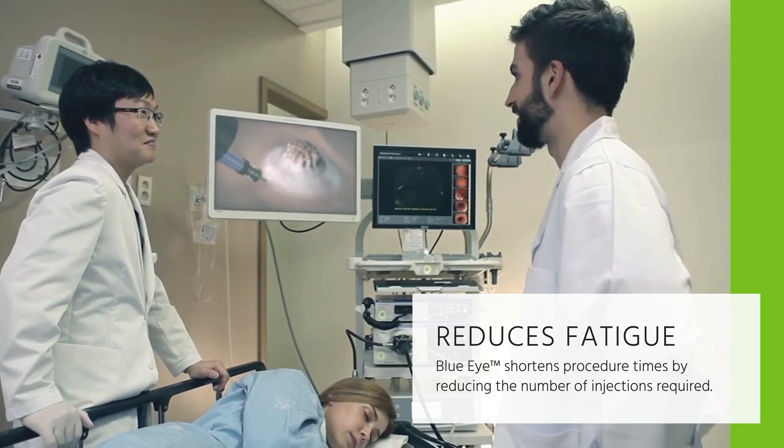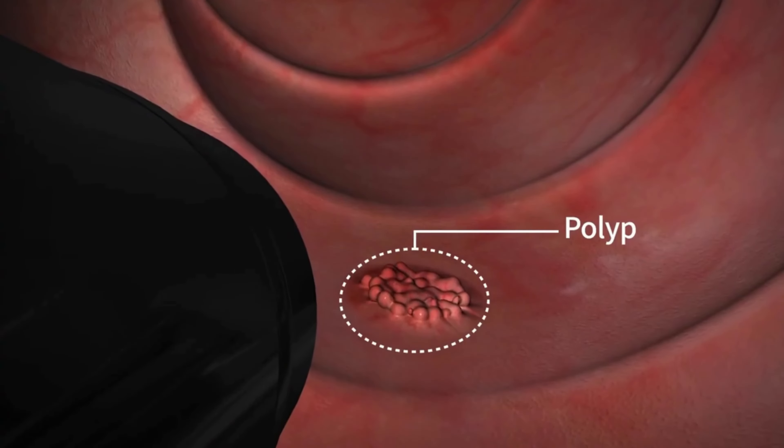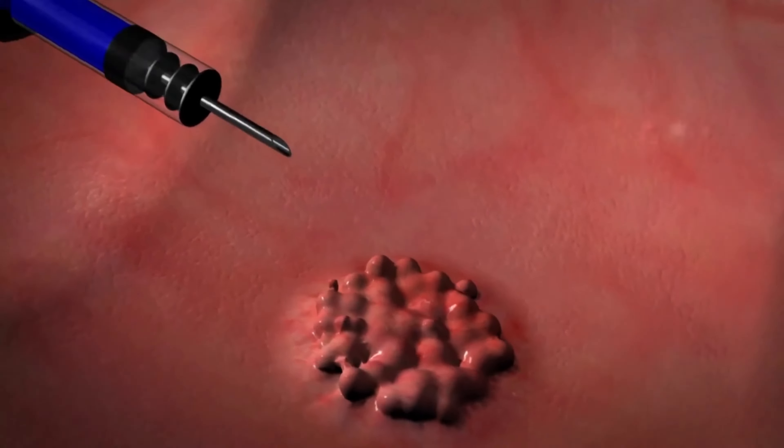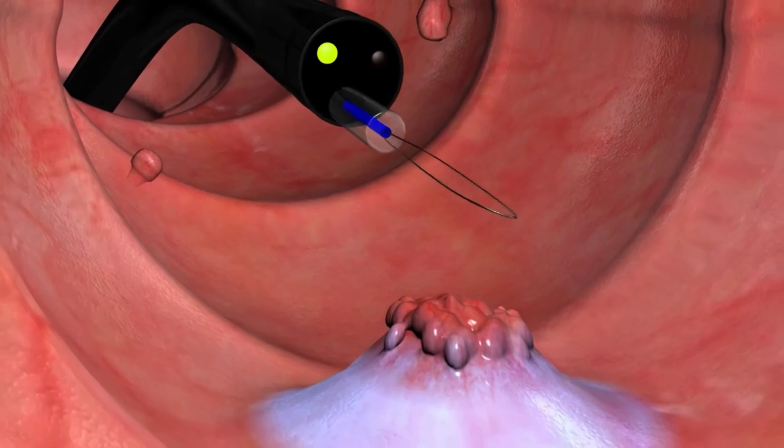BlueEye shortens procedure times by reducing the number of injections required. BlueEye is biocompatible, allowing it to be used safely to lift polyps, adenomas, early-stage cancers, and other gastrointestinal lesions for endoscopic resection.